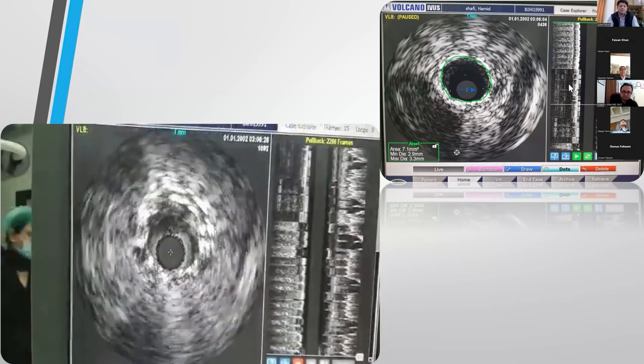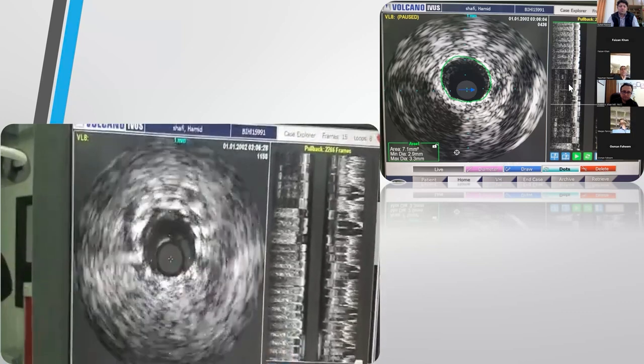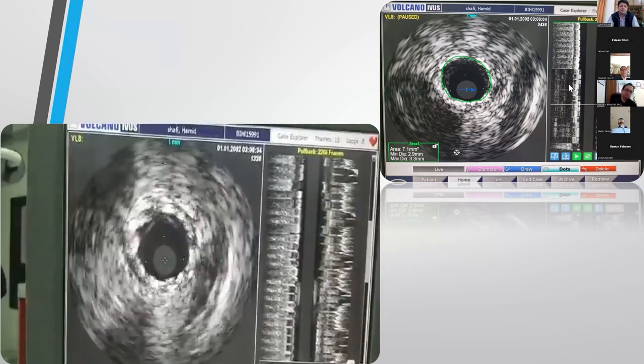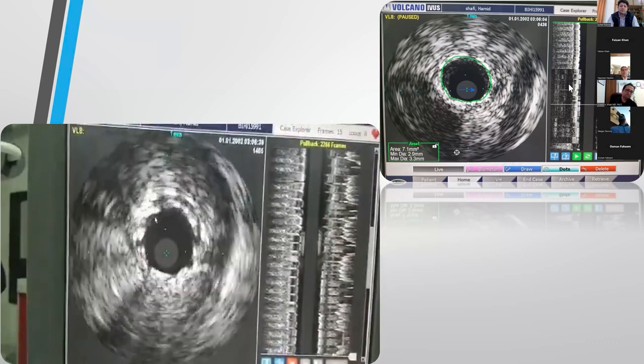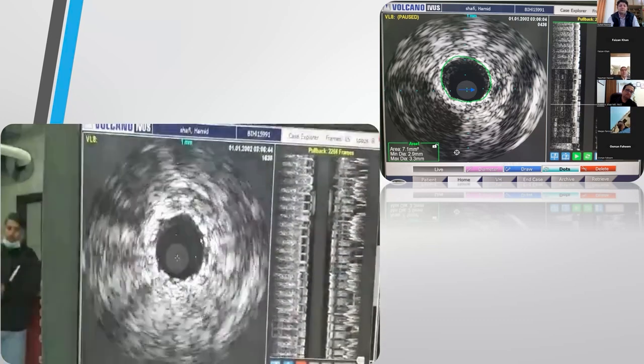इधर इस स्पॉट पे लगता है कि जो पिछला स्टेंट और स्टेंट के दरमियान हल्का सा गैप है. And you could see when you injected the saline over here, तो ये bubbles पीछे नजर आए थे. इस spot को थोड़ा सा रेड कर देते हैं. Lumen area बड़ा अच्छा है, expansion अच्छी है, but stent apposition भी थोड़ी सी और बेहतर हो जाए will be nice. तो यहाँ पे इसको थोड़े से high pressure पे operate कर देते हैं.